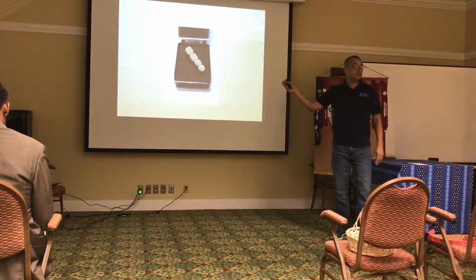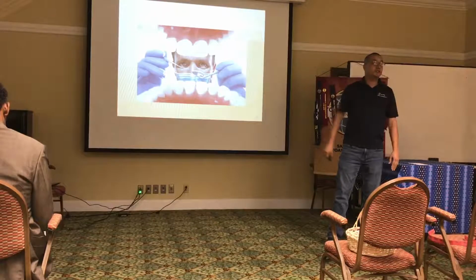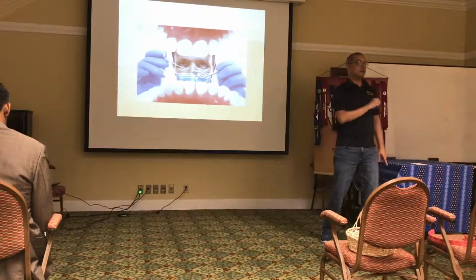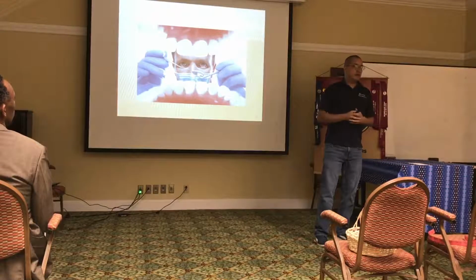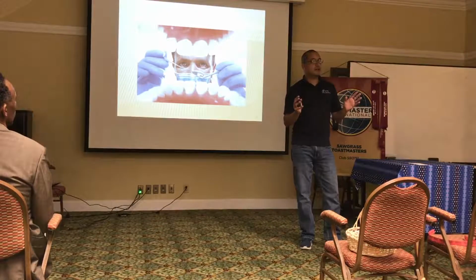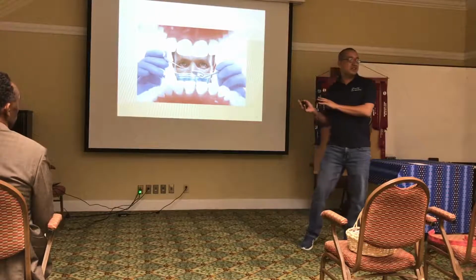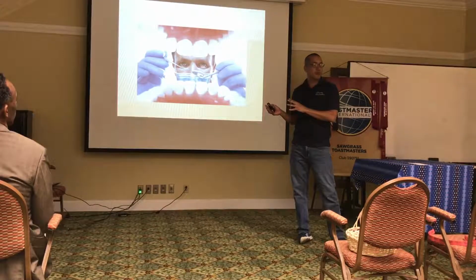You put it in a box, and after that, you send it to the dentist. And the dentist is the one that puts it in your mouth after we've done all the work. This procedure takes maybe around a week, a little bit more, depending on how complicated the case is. So if the dentist tells you, you gotta come back in 2 weeks, don't be mad. It's a lot of steps that you gotta go through to make this restoration.